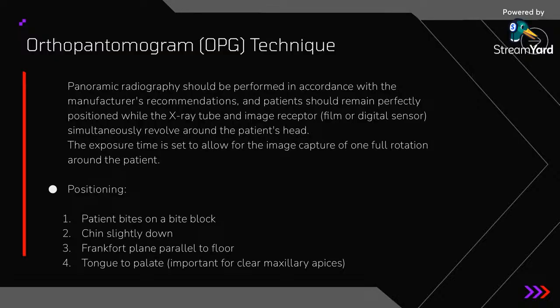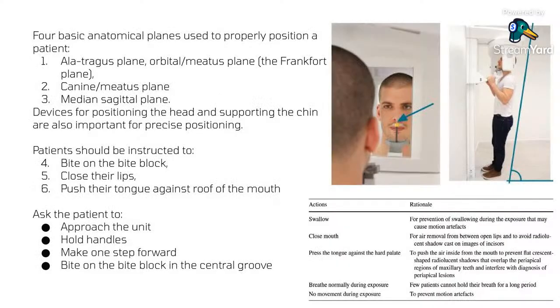We'll be talking more about this in the coming slides. So let's go ahead. Remember, positioning matters a lot. Staying still matters a lot. All right, so there are 4 basic anatomical planes used to properly position a patient.